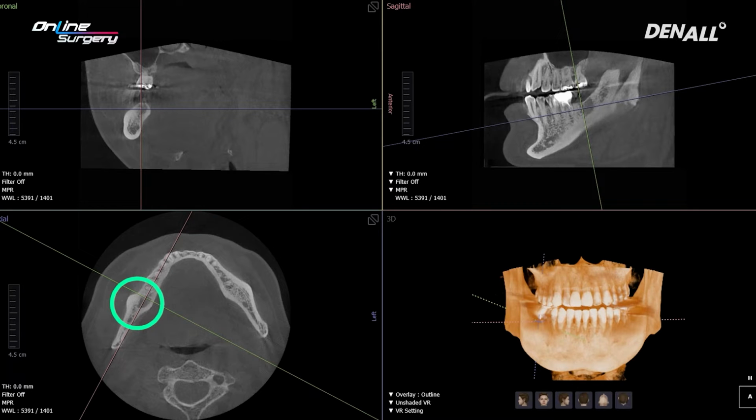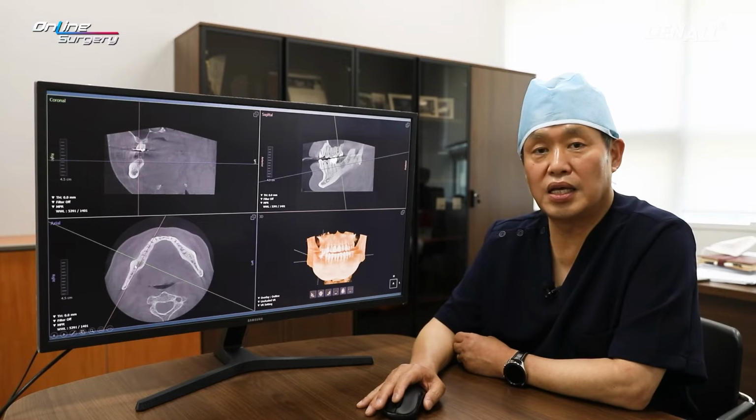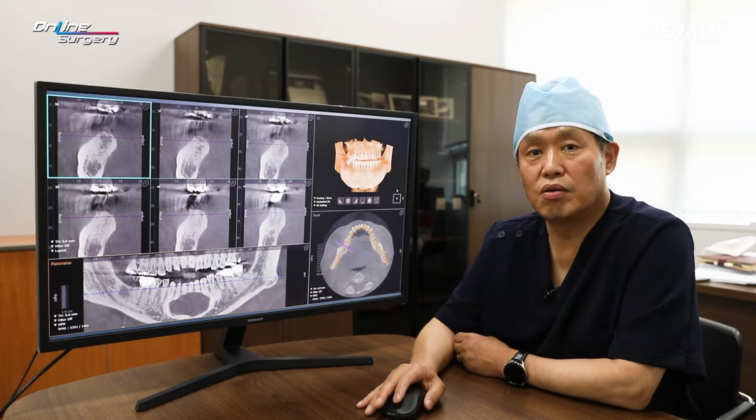Before extraction, due to some sort of chronic periodontitis, the surrounding bone was destroyed, and you can see that a sclerotic change has occurred on the CT. This is fully healed. In this patient, it is the most distal tooth, number 47.